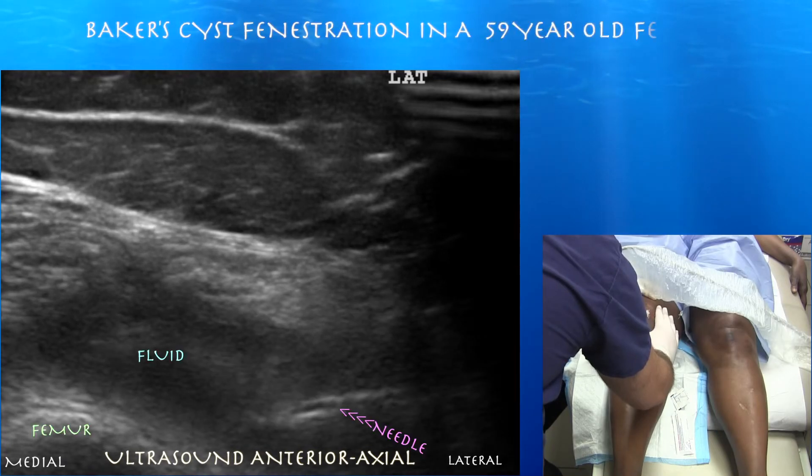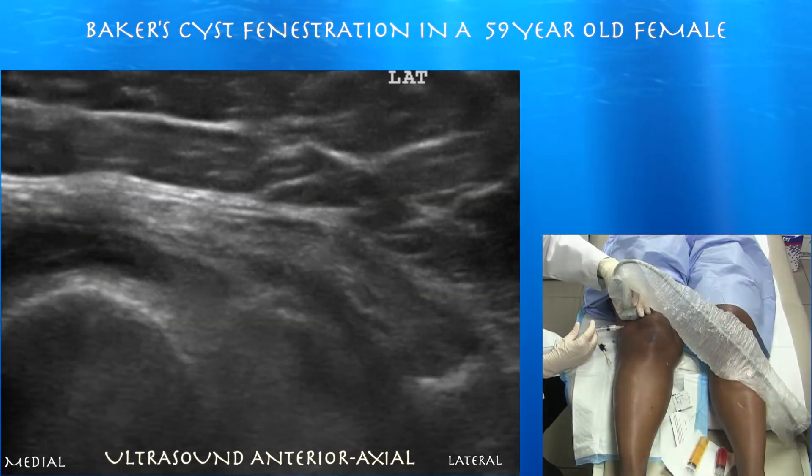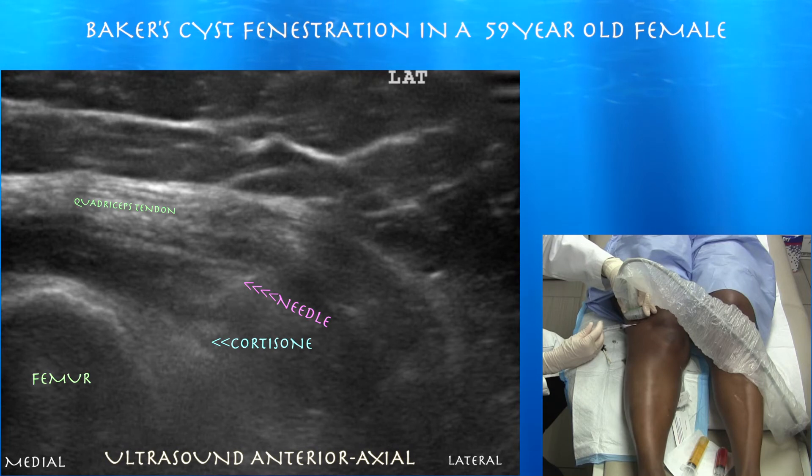Here you can see the needle in the suprapatellar pouch during the beginning of this procedure. Also notice that the assistant is pushing on the medial side of the knee to try to push the fluid laterally.